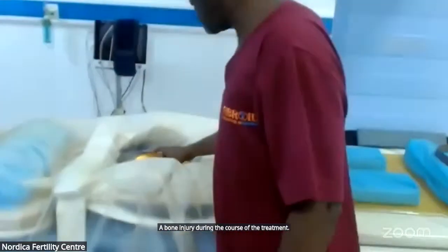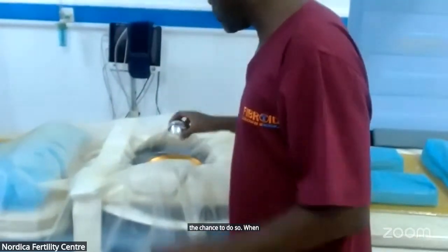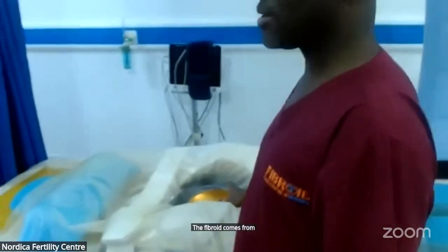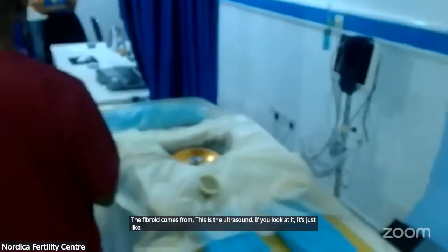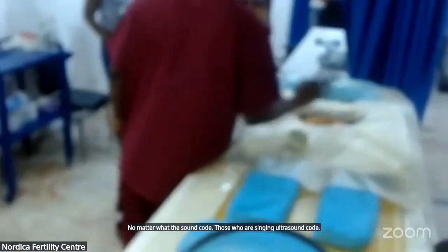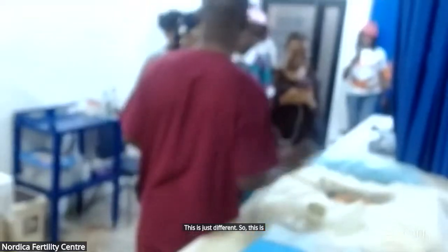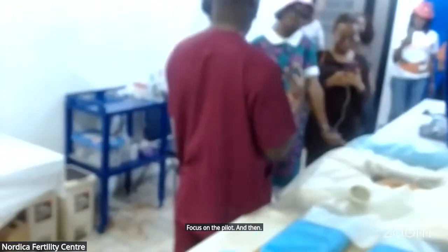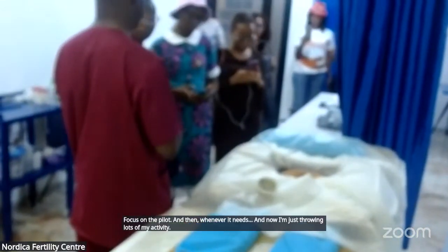Now, this is the transducer, where the energy that we use to kill the fibroid comes from. This is the ultrasound. If you look at this, it's just like the normal ultrasound probe. Those who have seen an ultrasound probe before, this is just different. So this is what we control. We focus on the fibroid, and then it generates heat that destroys the blood supply to the fibroid.